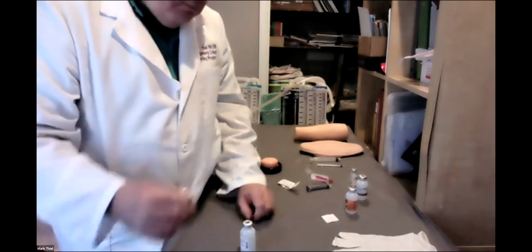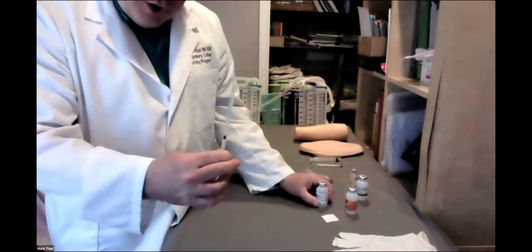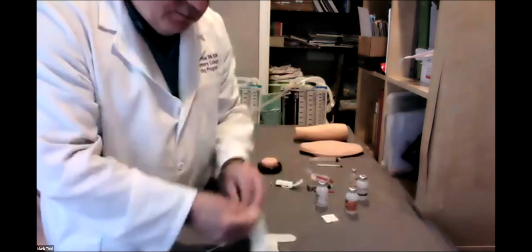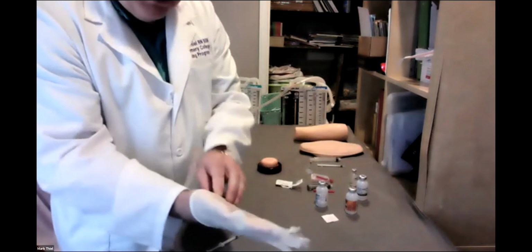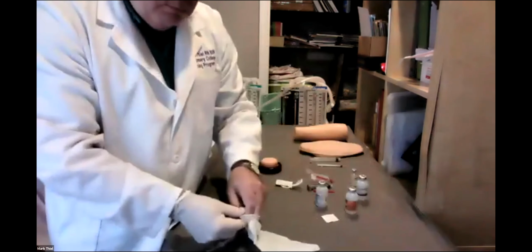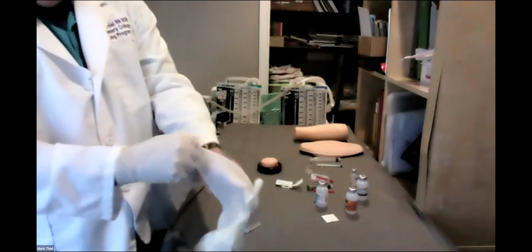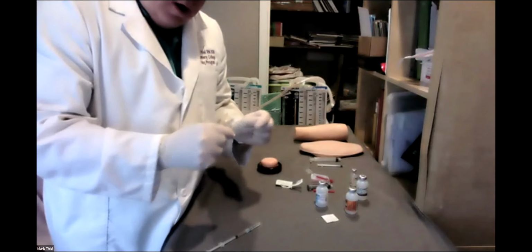Ready? You're ready now to go and inject. What did I say earlier in the lecture? I'm going to go touch the patient now. Now I'm ready.